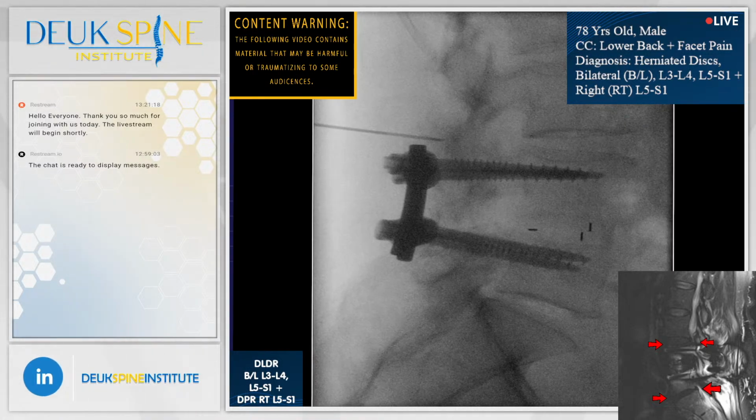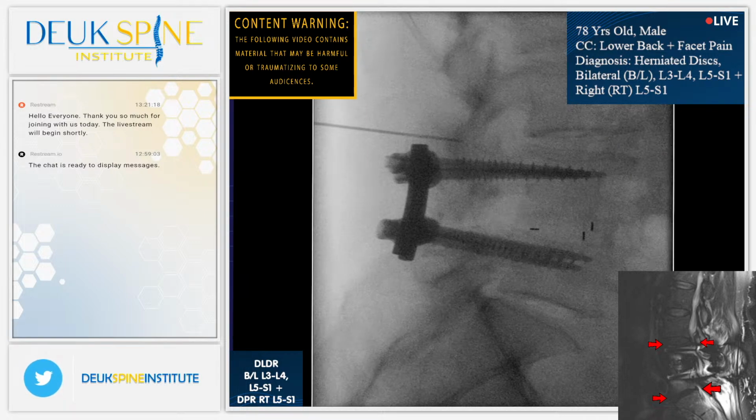If you look at the fusion there on the x-ray, his bones are supposed to be curved backwards, but they're straight. And that's because the surgeon did not take out the abnormal facet joints that are in the back of the spine. If you take those facet joints, and you can see where the facet joint is, right where I'm passing now with my needle, it's abnormal. It's about 3 times bigger than it should be. Those sclerotic facet joints block the surgeon from reducing the spine into lordosis, which is the proper curvature of the spine.